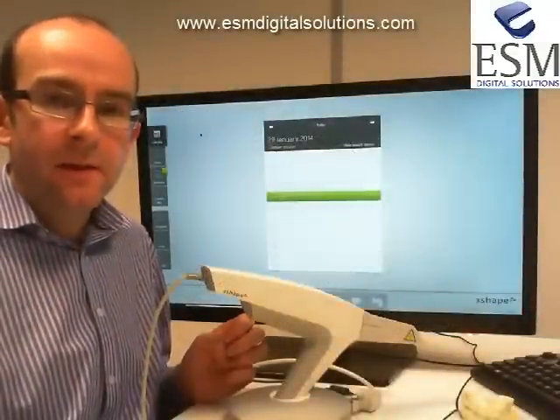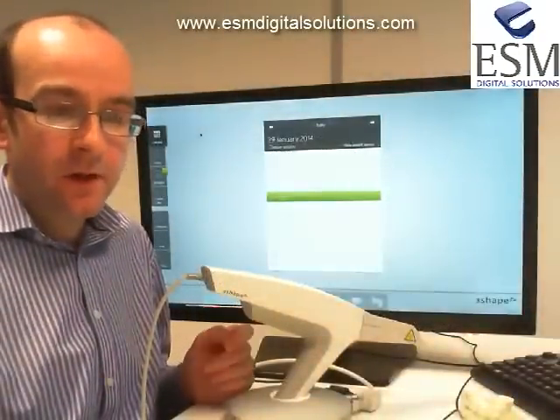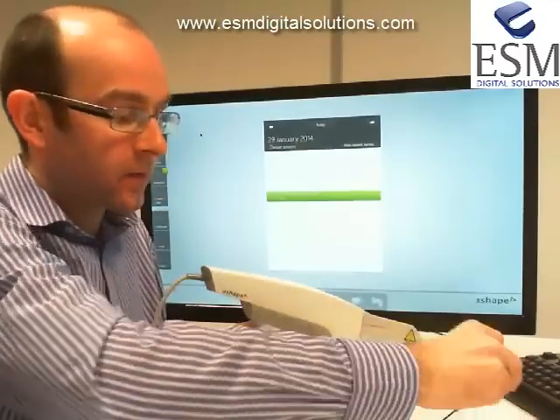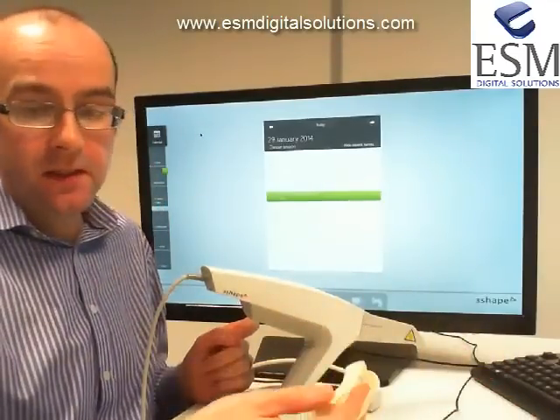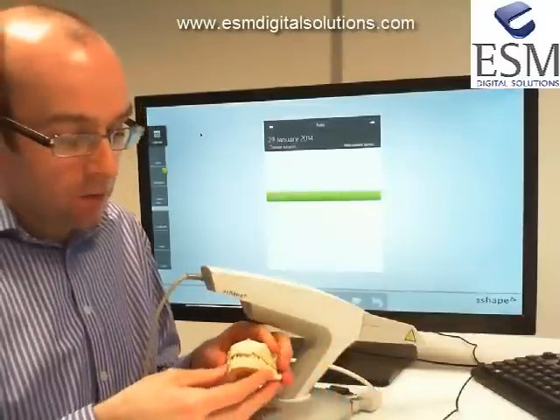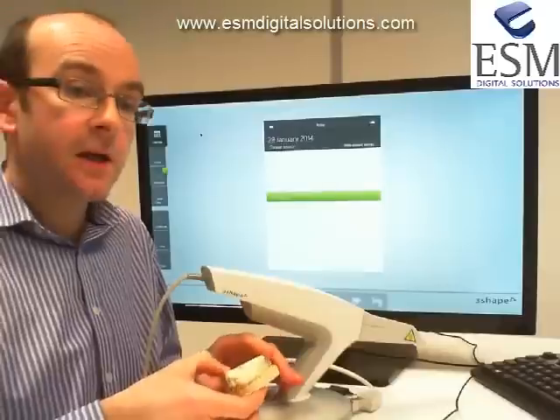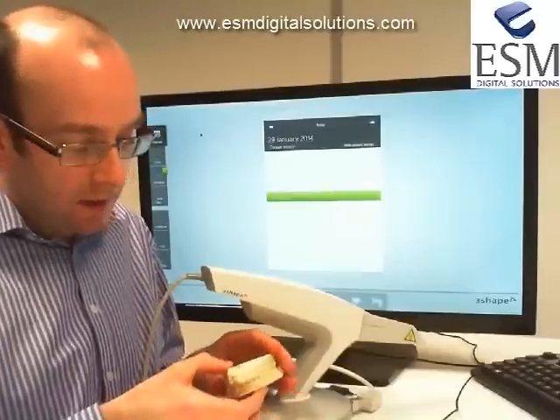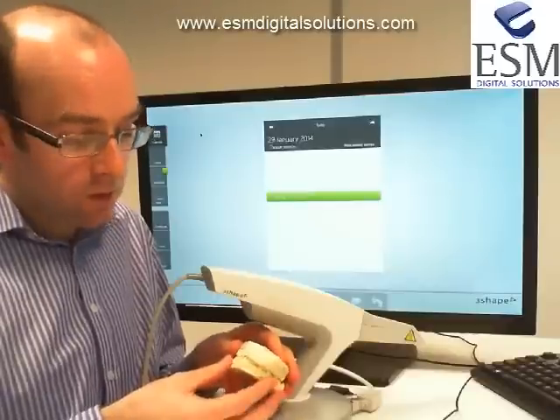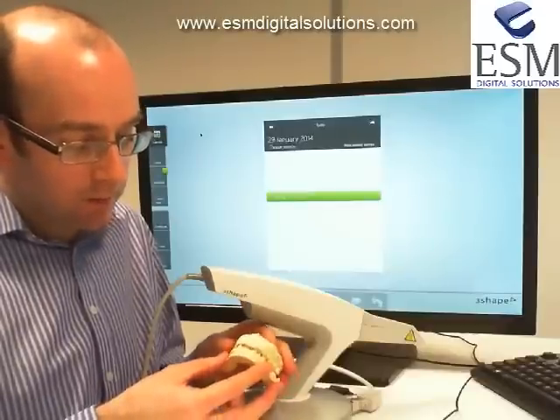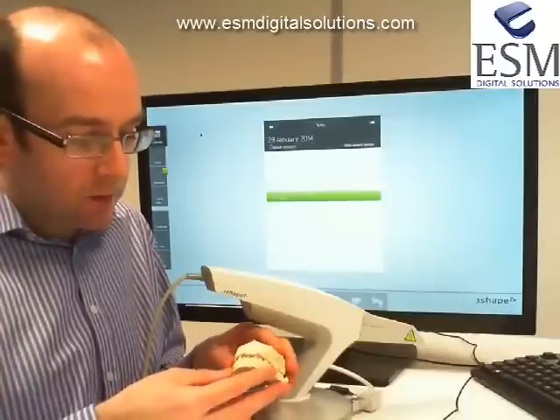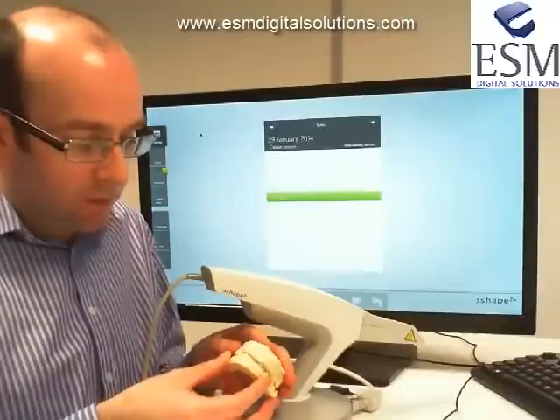Hi and welcome to another ESM training video clip. In this clip I'm going to take you through the TRIOS scanning process for a set of orthodontic models. We're going to work with just a standard set of stone models. This will give us a good overview of TRIOS - how we create an order, how we use the scanner, and I'm going to point out some tips and tricks to help you get a really good scan using best practices.